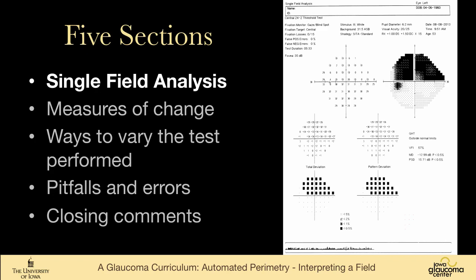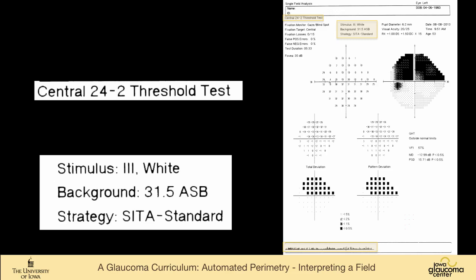So first, let's look at this visual field. This is a patient of mine who has a dense superior arcuate scotoma from glaucoma. As we look at the field, we see that it's a central 24-2 threshold test. That's the default in our department. You can use a 30-2. There are other sizes, and we'll talk about that.